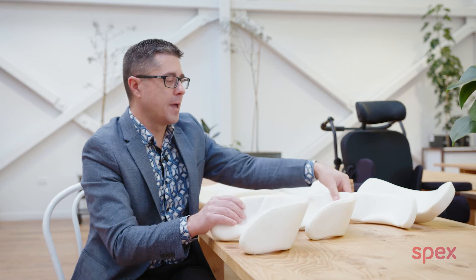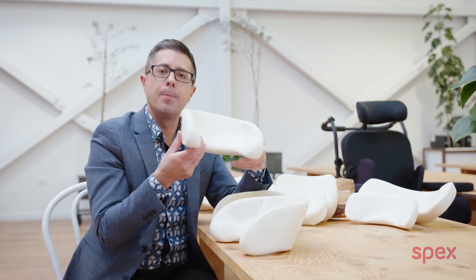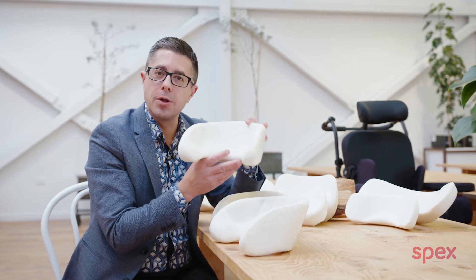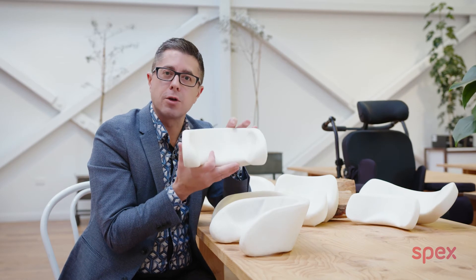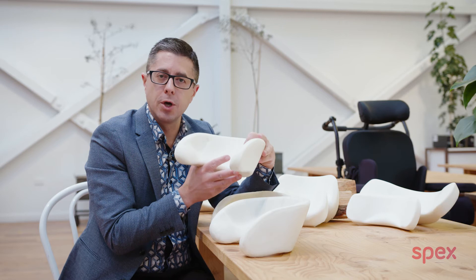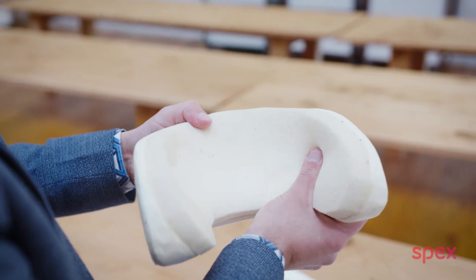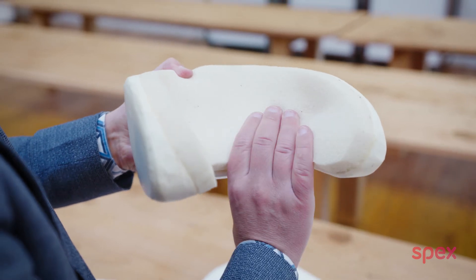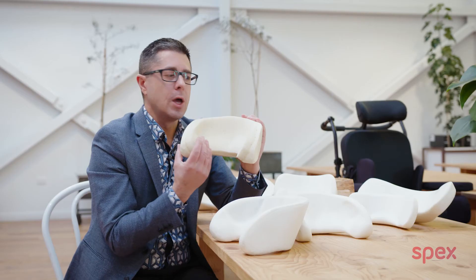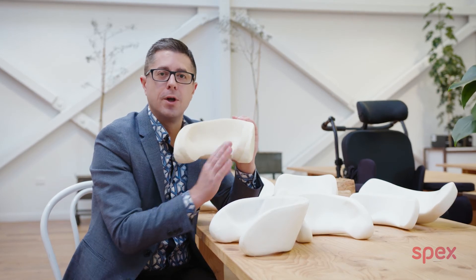These head support pads come in the extended and also the version cut back by five centimetres. We are also pleased to introduce the new paediatric range. The paediatric extended lateral head support pad is for younger children who need really nice cradled support — children who have low tone or issues with head positioning and developing head control. With the extended lateral head support pad, we include as standard a comfort memory foam glued to the entire front and internal surface of the head support.